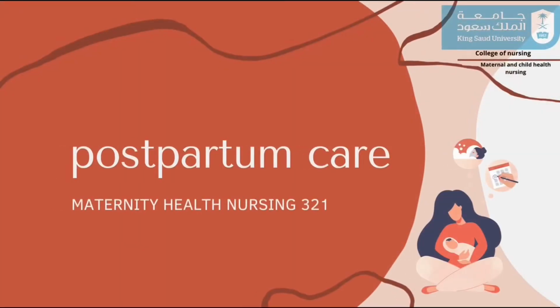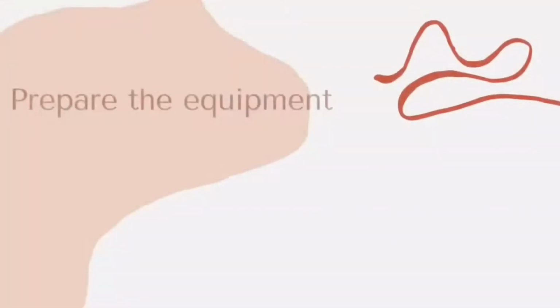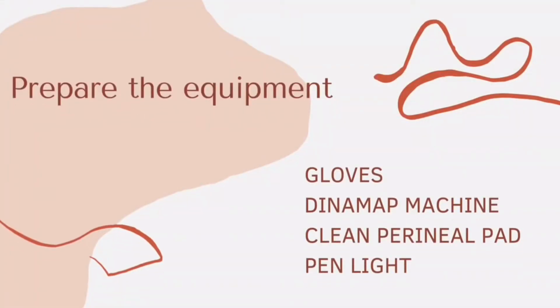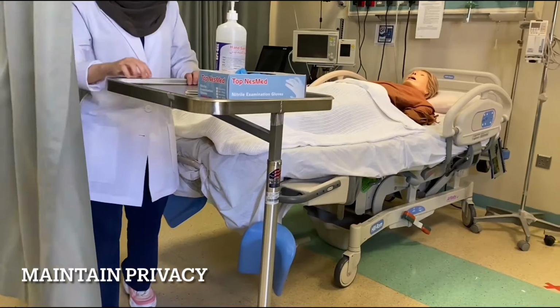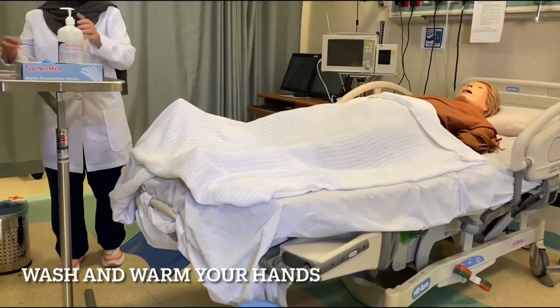In this video, we are going to show you how to do a clinical examination for a woman in postpartum care. Prepare the equipment: gloves, Doppler machine, clean perineal pad, and pen light. Maintain the privacy. Wash and warm your hands.